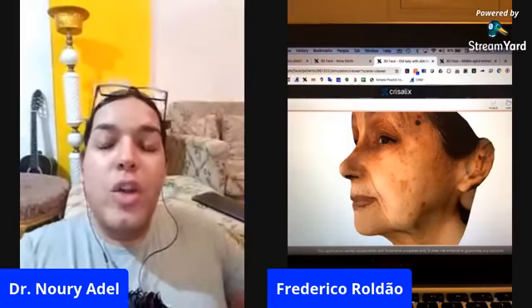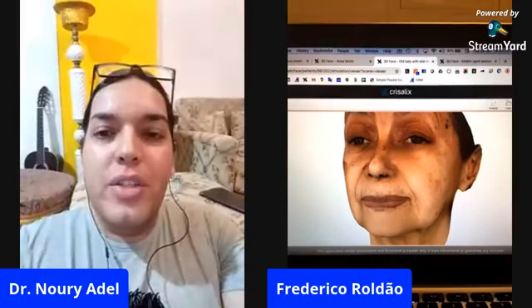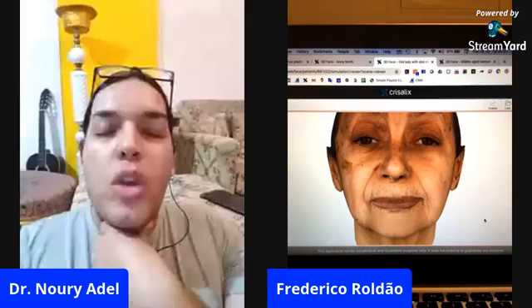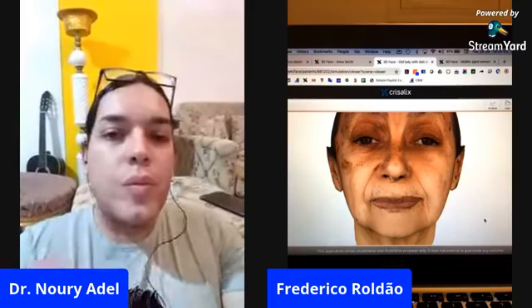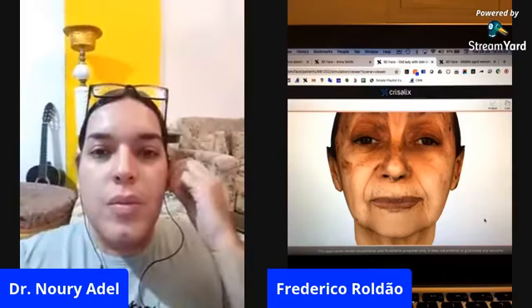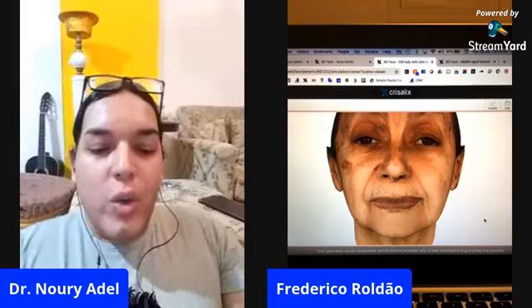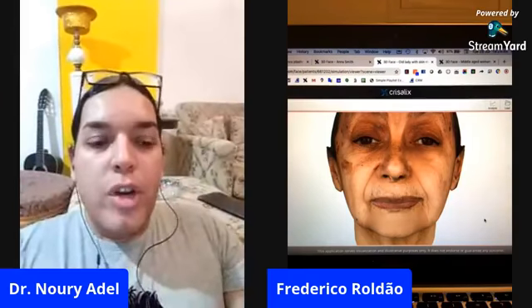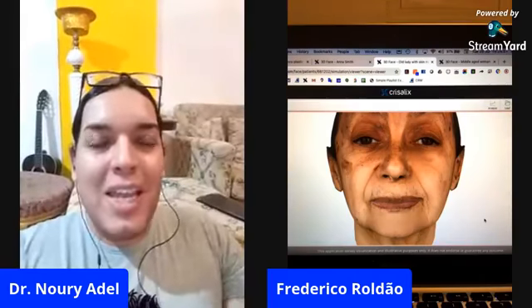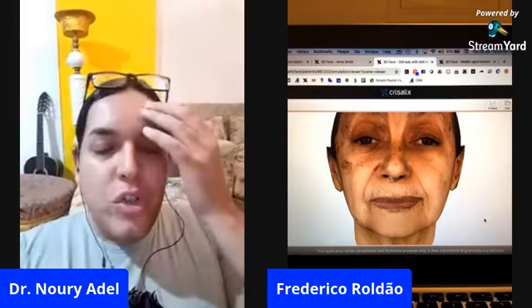Frederico, can this software also be used with dynamic pictures or dynamic videos, or do we just have to manipulate the face at rest position? Sorry, I didn't get that because there were some cuts on the line. Can you repeat your question, please? I was just asking, can this software be used for dynamic videos or dynamic pictures, like if the patient is smiling or frowning or laughing, or do we just have to manipulate the picture during rest position only?